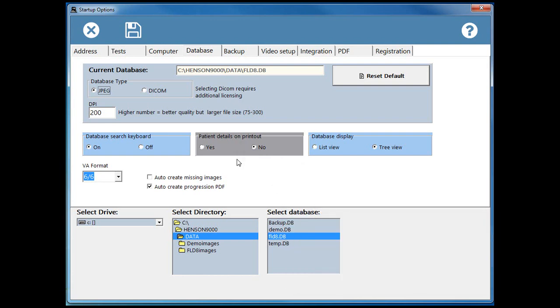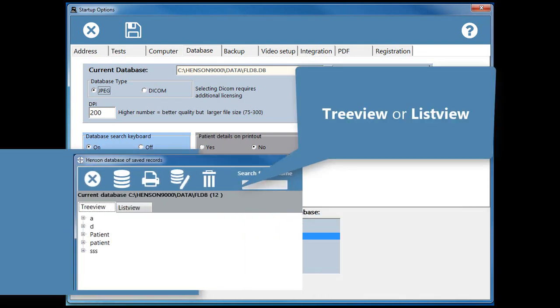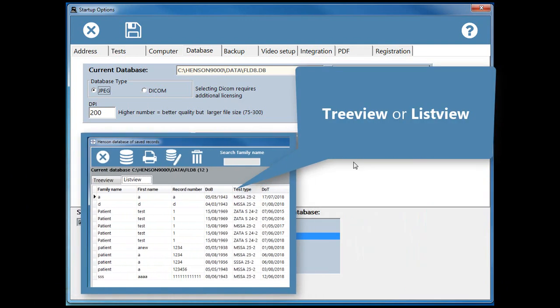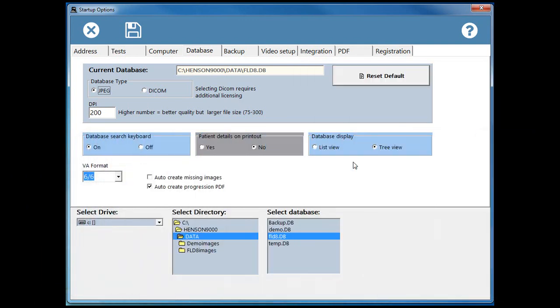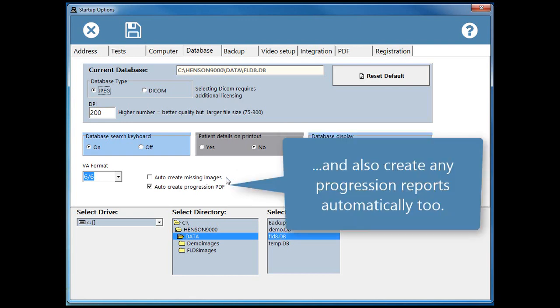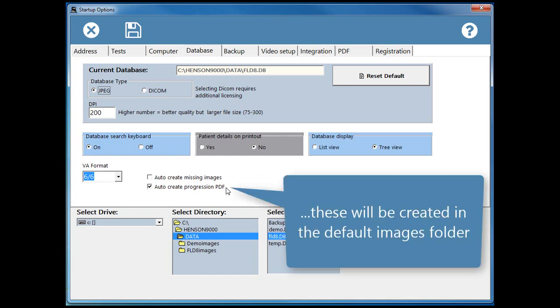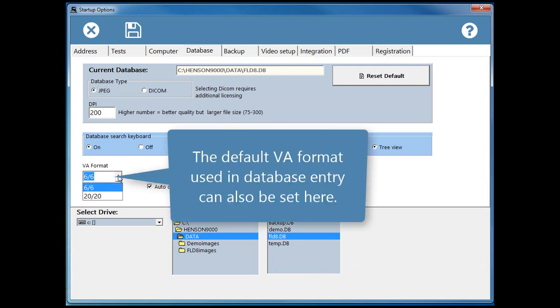The default view for the database is set here: tree view or list view. The software can automatically create any missing database images and also create any progression reports automatically too. These will be created in the default images folder. The default VA format used in database entry can also be set here.